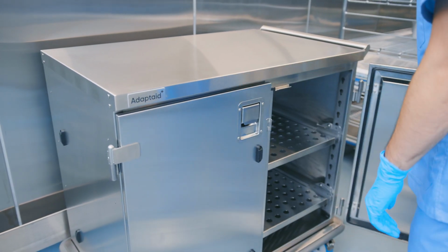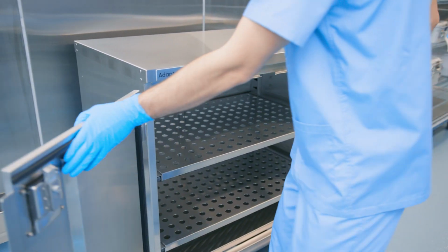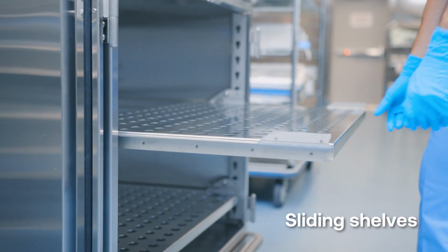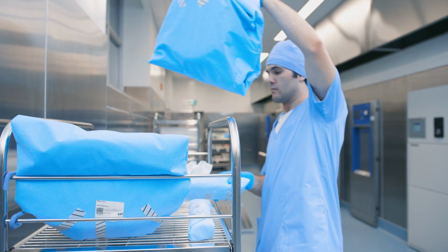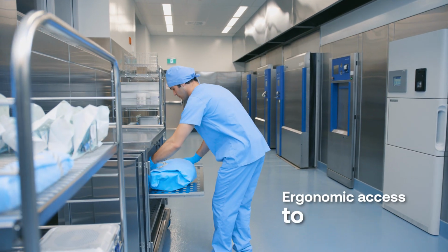To facilitate loading, a magnetic device holds the folded doors on the side. Sliding shelves provide better access to medical devices inserted at the back of the case cart. This helps reduce the risk of musculoskeletal injury.